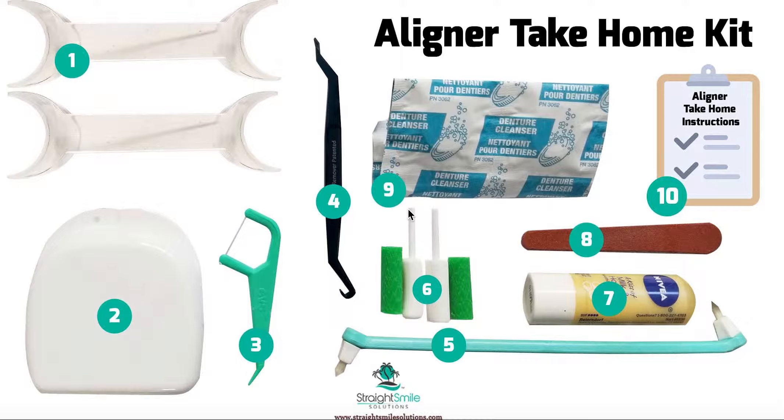Number nine is gonna be tablets to clean the aligners — it's really nice, and they can buy the rest at Costco. Number ten is your aligner take-home instructions. I don't think it comes standard anymore — I think you have to make your own. Informed consent will come standard with Invisalign and ClearCorrect, which you can print and have everyone sign. But take-home instructions you'll need to create yourself. Straight Smile Solutions clients — we're glad to help you customize those as part of our concierge package.